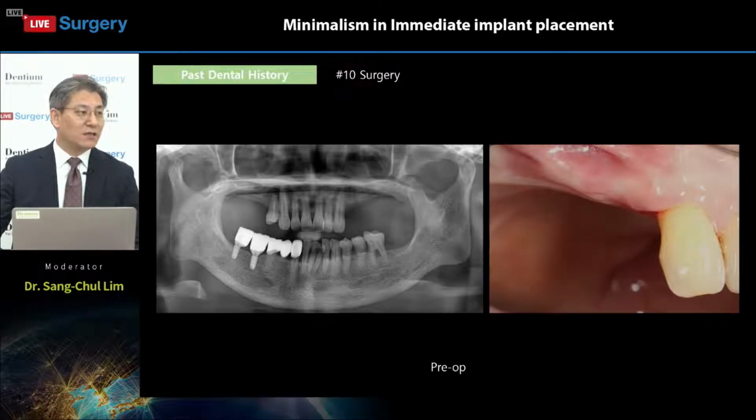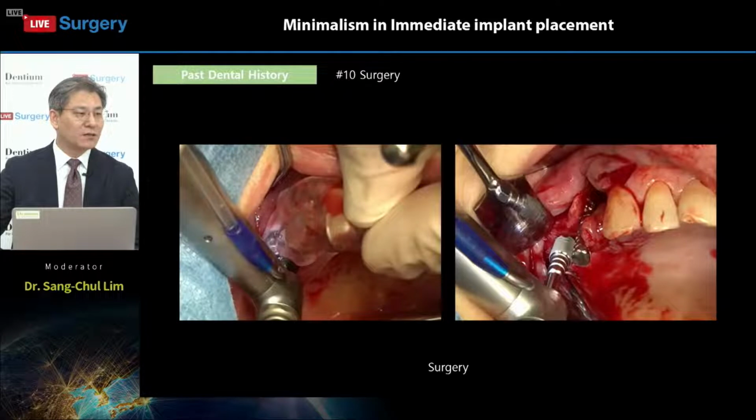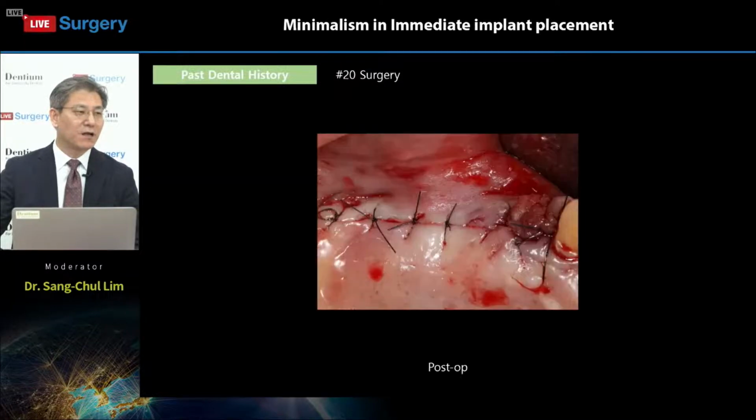This is past dental history information. The upper right molar area received a Bright bone level implant surgery with sinus elevation. Using this digital guide, sinus elevation and bone grafting were done, and Bright system bone level implants were installed with 3 fixtures and the GBR procedure on the number 14 area. Finishing all the procedures and the suture.